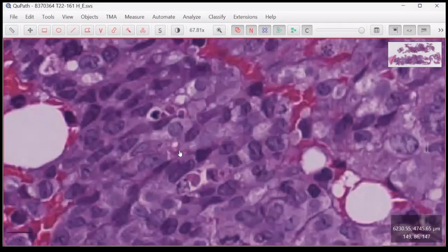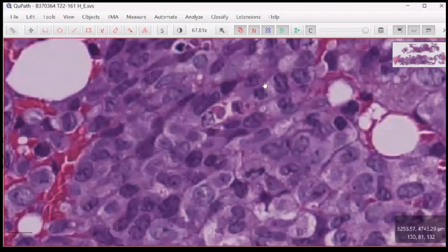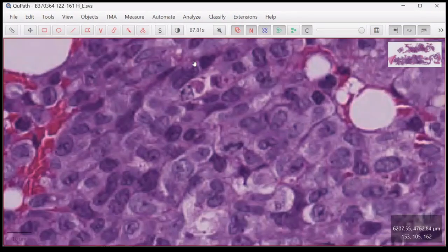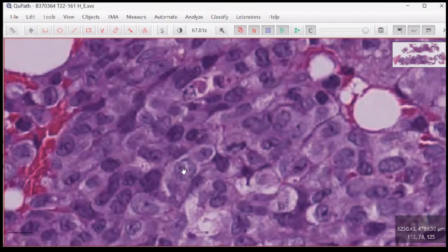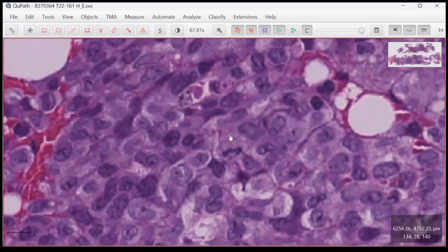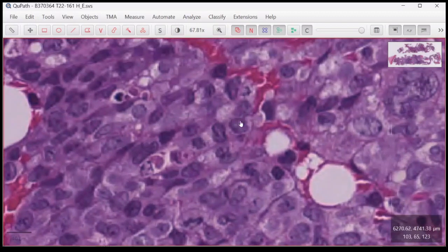And these cells vary from round shape, all displaying vesicular nuclei, with some having conspicuous to large nucleoli. And the others are large cells with indented nuclei and monocytic differentiation. Here we have cells with indented nuclei with monocytic differentiation. Yeah?